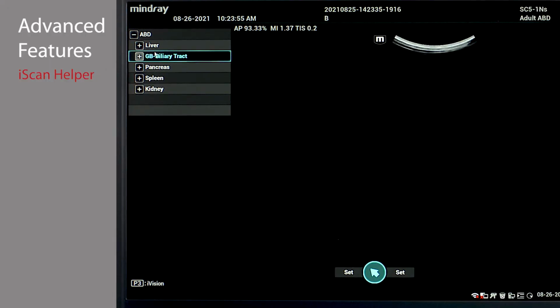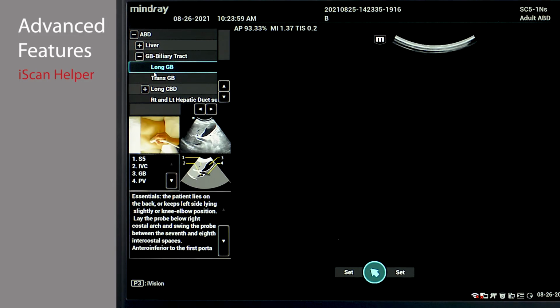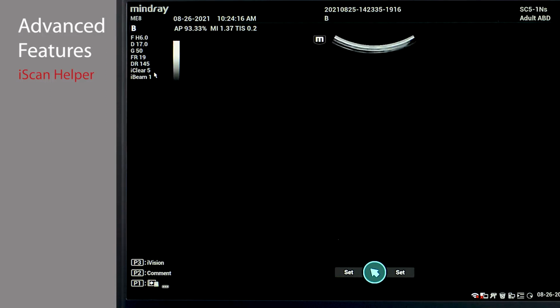Select the target view and the system will display 4 different informational screens. The system will display an image which portrays proper transducer placement, desired ultrasound image, a graphic pictorial, and additional scanning tips. Tap the iScan Helper icon to exit. Please note, images cannot be saved while iScan Helper is active.